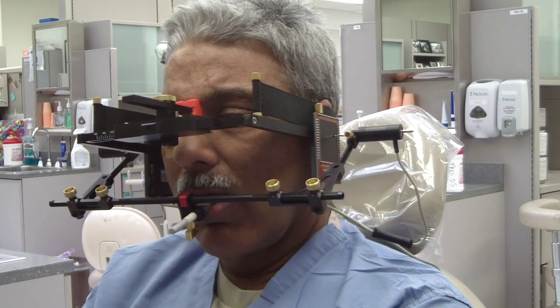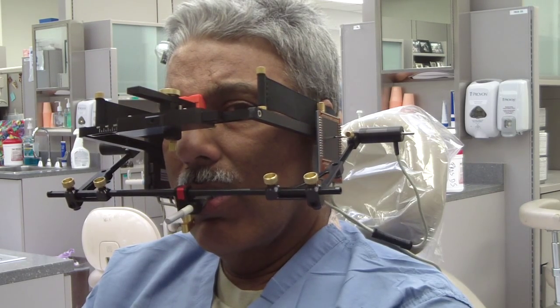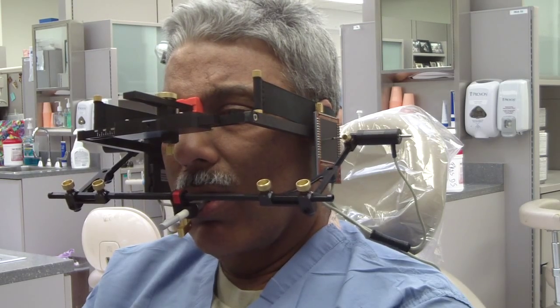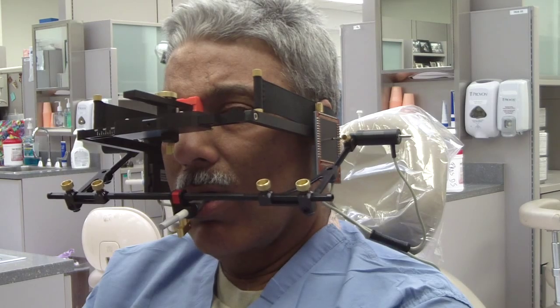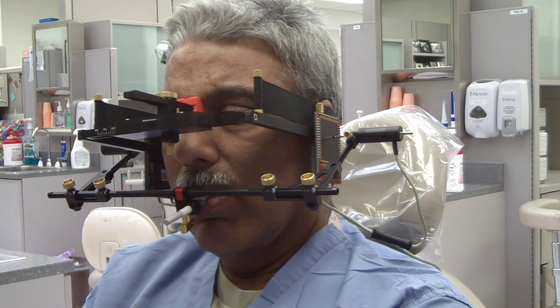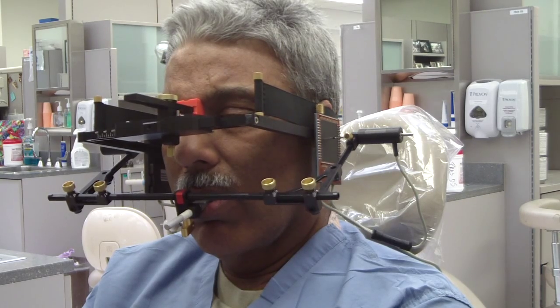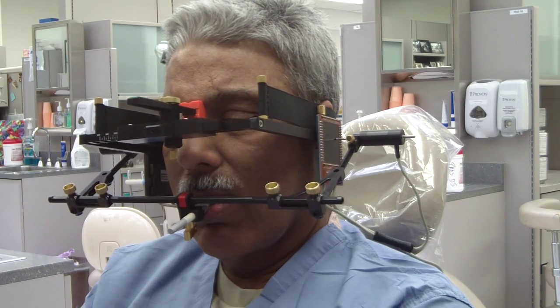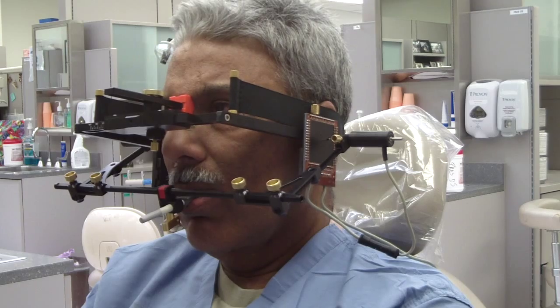Its main purpose is to figure that out, and also to see if you can consistently get a reproducibility of your jaw movement. It traces the jaw movement on the graph, and if it's pretty consistent then you should see a uniform pattern of lines — but if the patient has TMD issues, then you're going to see the lines everywhere.